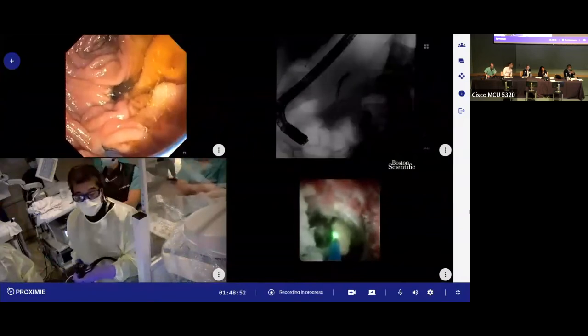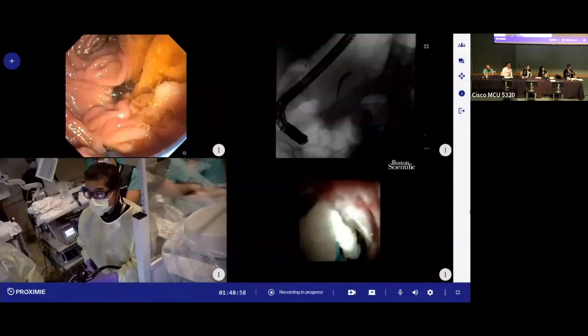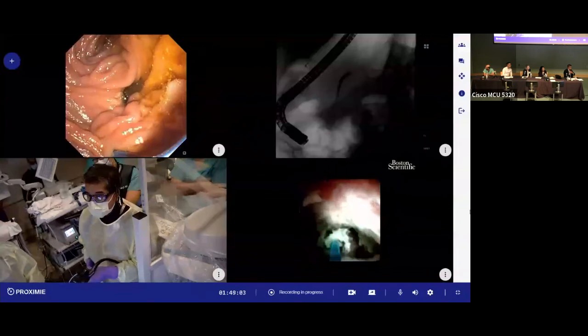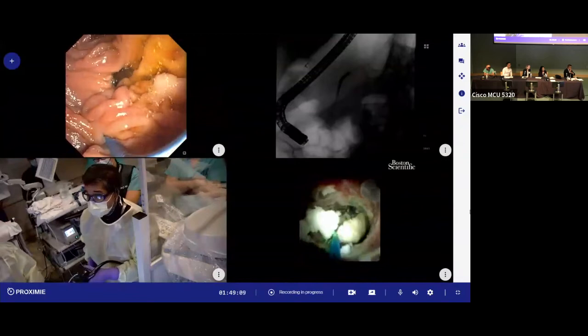Oh, so we're still just in the downstream body, would you say? Yeah, downstream body, above the genu. And you have to have a really light foot with laser. It's not like fluoro in your second year of fellowship.